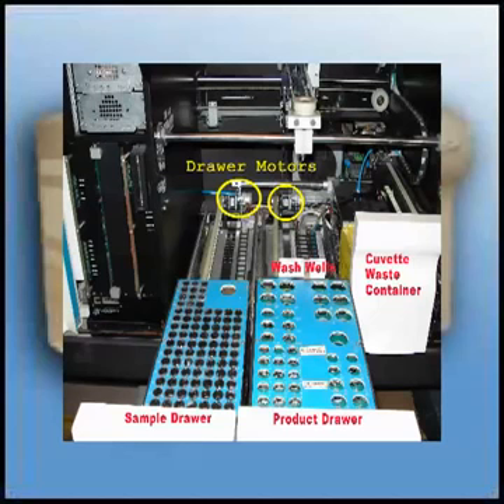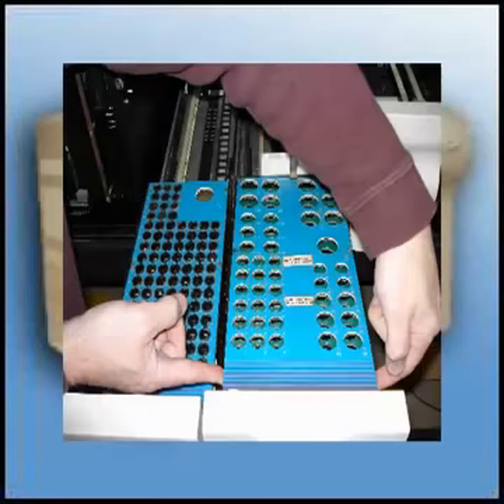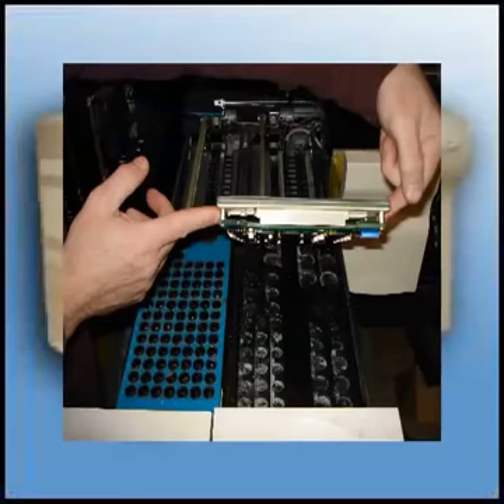Both drawers contain a sample and a reagent display board, and a sample and product detection board. They are easily removed by putting two fingers under the display board at the front of the unit and lifting up. The most common problem for one spot not to be read is pieces of label blocking the light path of the detectors. Cleaning will resolve those issues.